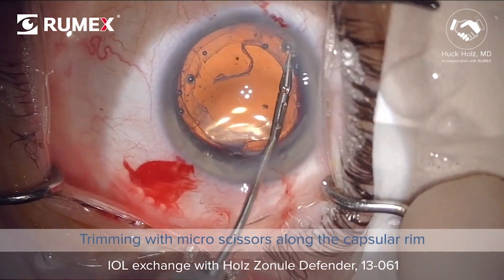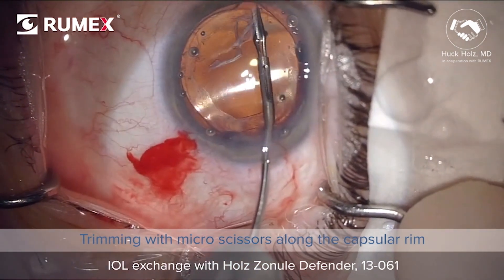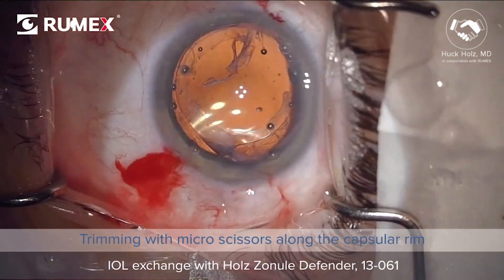This lens is then gently elevated above the capsule rim, once you have removed all these fibrotic bands.